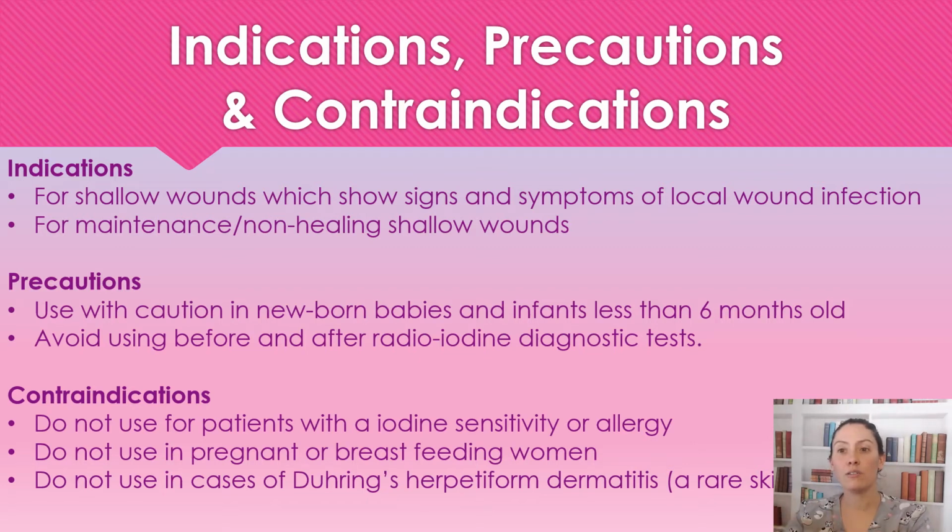You can also use this for maintenance or non-healing shallow wounds or prophylactically for wounds. So if it's in an area that's at high risk of becoming infected, you can use this there.